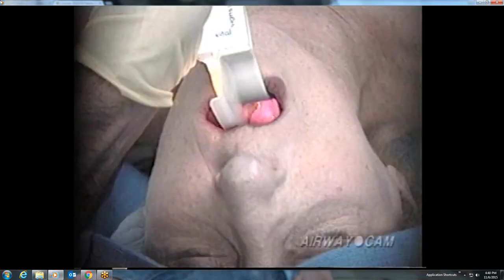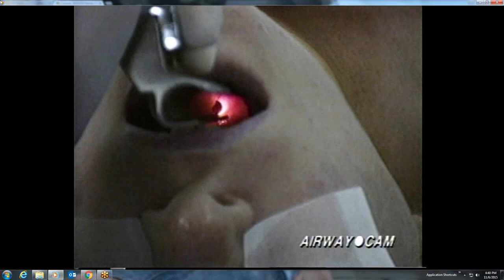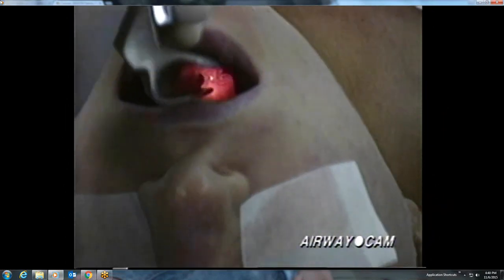If neither the epiglottis nor the posterior cartilages are visualized after blade insertion, the pink mucosa represents either the posterior pharynx, in which case the blade needs to be inserted further, or the esophagus, in which case the blade needs to be withdrawn. Entrance into the esophagus following blade insertion is very common with a large Macintosh No. 4 blade or the longer straight blades.